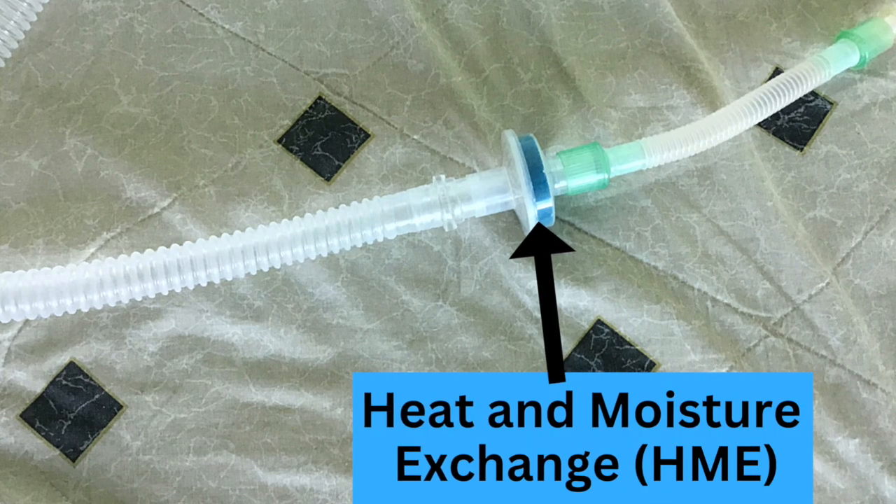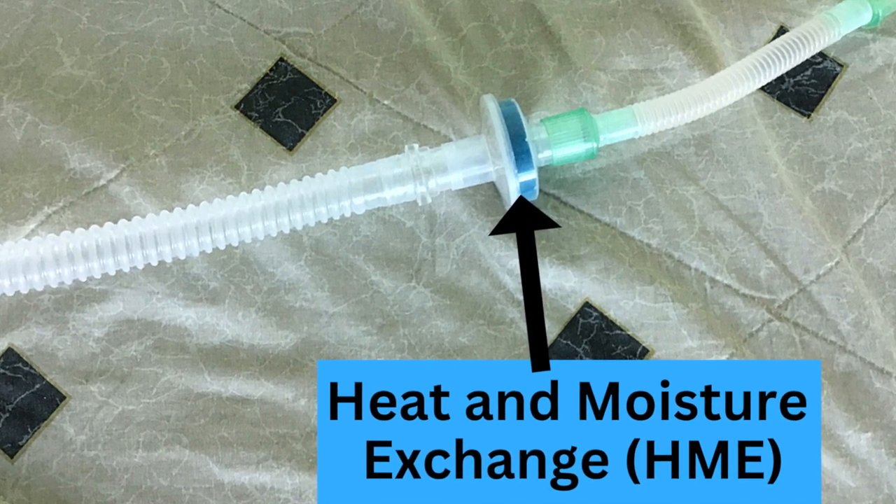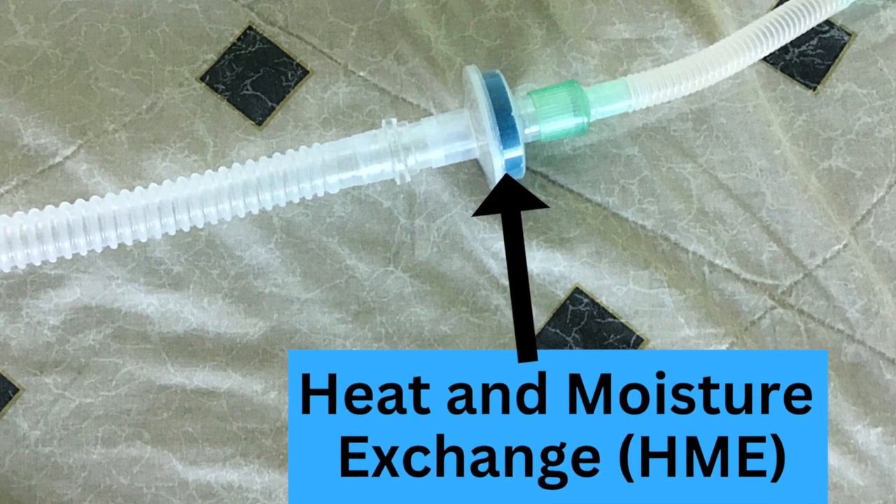I will place a small device called a heat and moisture exchanger in the tubing circuit. The heat and moisture exchanger will help keep my airway moist while I am not attached to the heated humidifier.